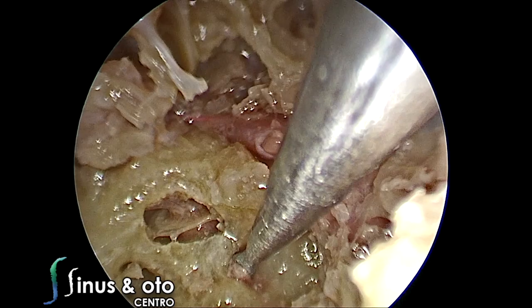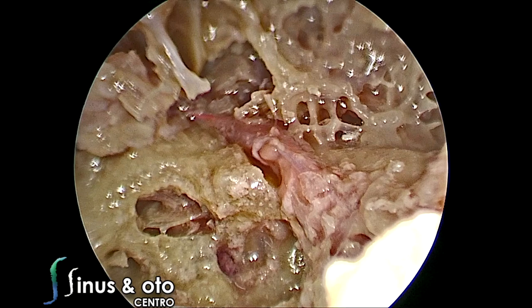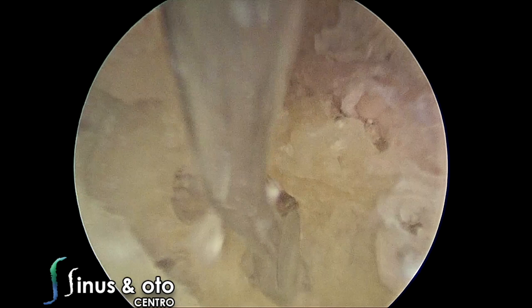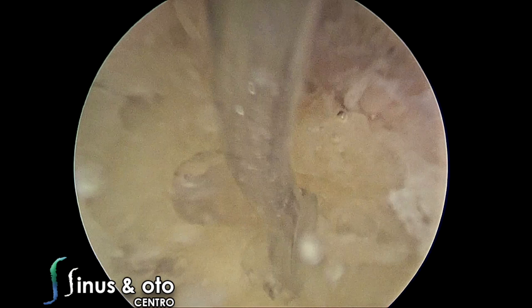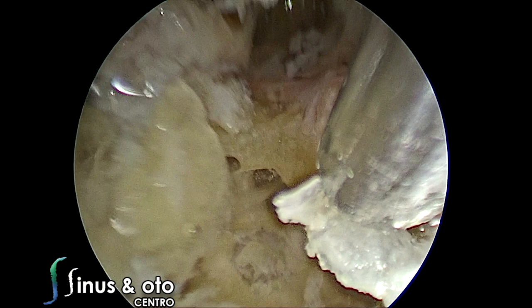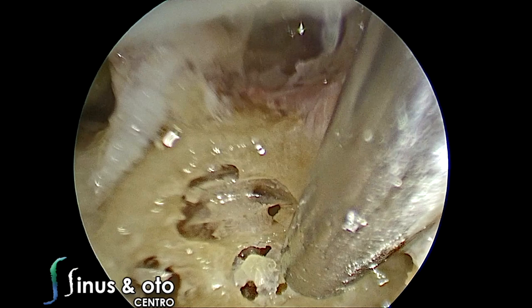In the triangle we create from the cochleariform process, the vestibule, and the most apical turn of the cochlea, we can go inside and dissect into the inner ear. If there were a live patient, once you open this, a CSF leak would start from the inner ear, from the central nervous system. We are using the piezo, trying to preserve the nerves and soft tissue while removing bone — it's an underwater dissection. Using the piezo, we go inside the inner ear to expose the modiolus — the region I call the Christmas tree — and the region of the cochlear nerve.